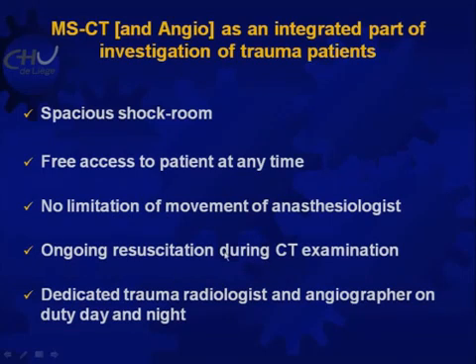The resuscitation is going on during the CT examination because it takes less than 5 minutes to get the complete investigation of the trauma patient with the CT. So it's not a special examination, another process. It is really integrated. The diagnostic CT of the trauma patient is integrated in the resuscitation of the patient. And there should be, of course, in order to have the machine functioning, dedicated trauma radiologists and angiographers on duty day and night all the time.